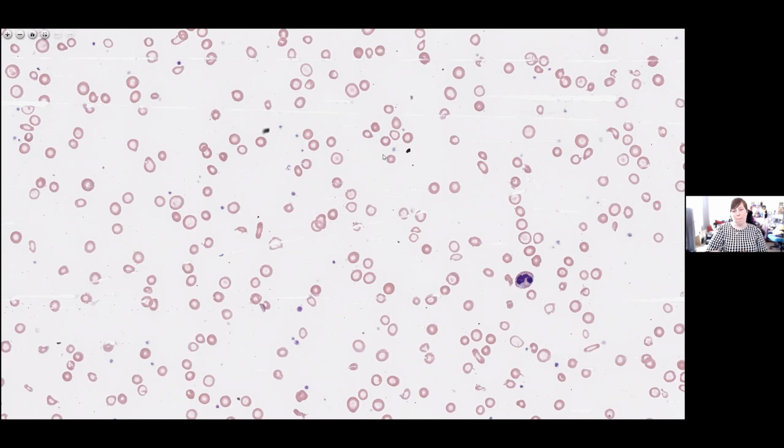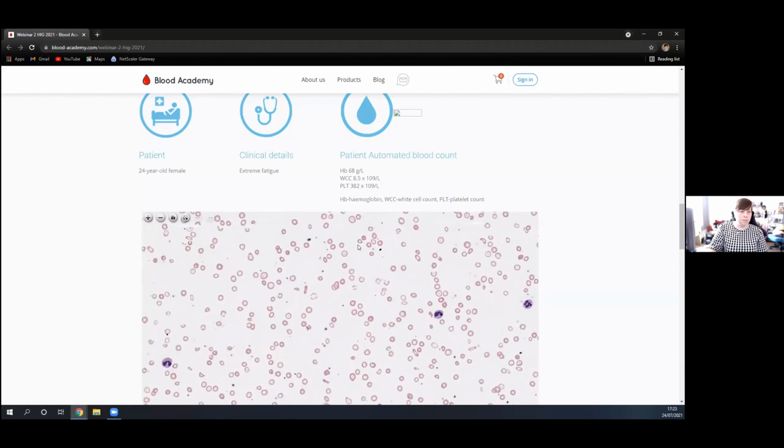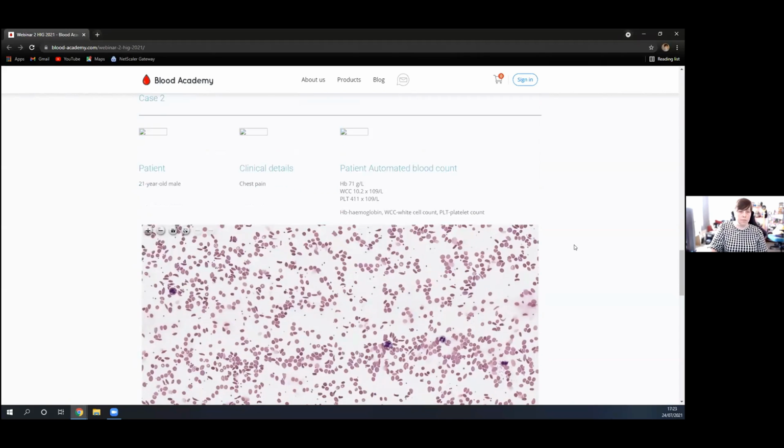So for the interest of time, I think we need to move on to case 2. Sure. We've got some other questions. If we do have time at the end, we'll try and cover them. But we've got a lot to get through with the other 2 cases.